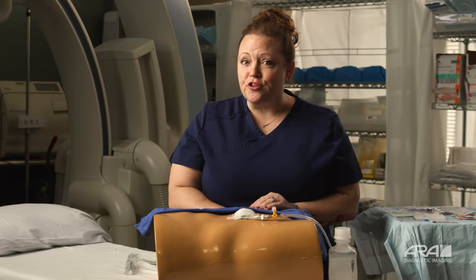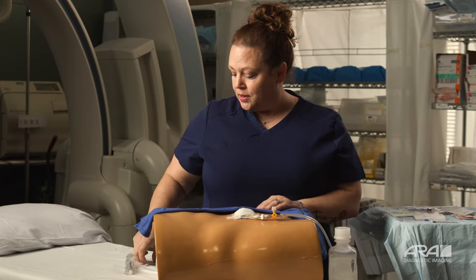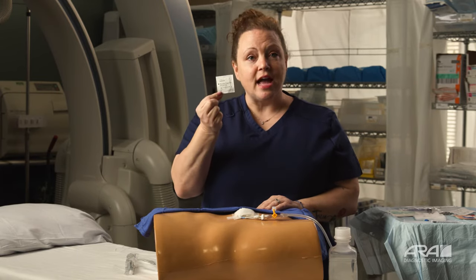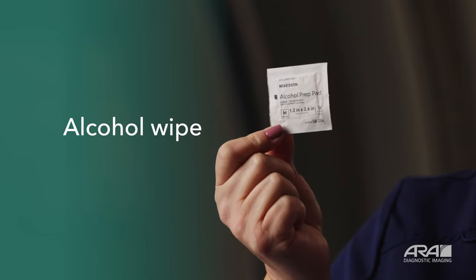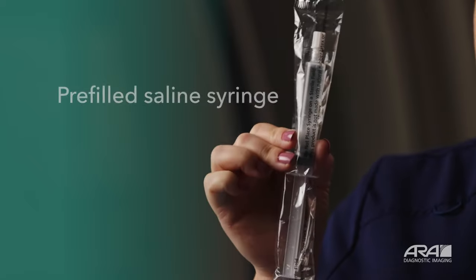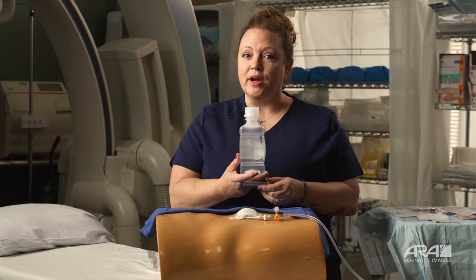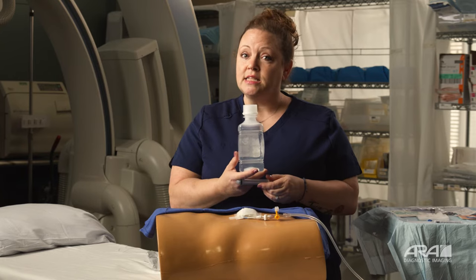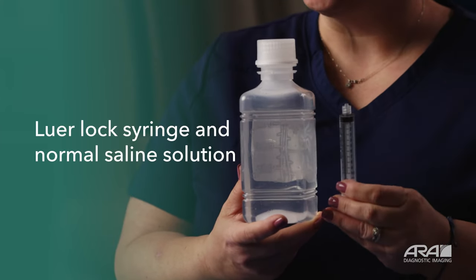Let's talk about flushing your drain. We want to make sure we have a few things ready when it's time for you to flush your drain. Make sure you have something to clean your access point, like an alcohol prep pad. You'll also need either a pre-filled normal saline syringe, or a bottle of saline solution and one of your luer lock syringes.